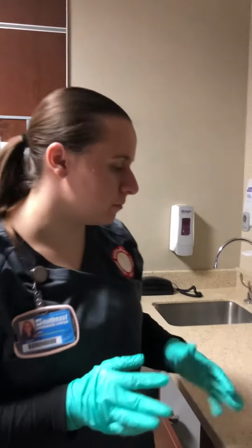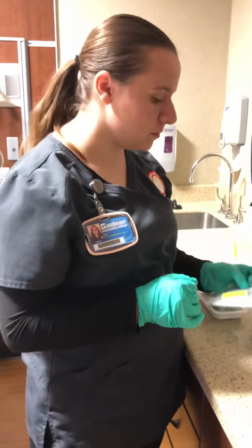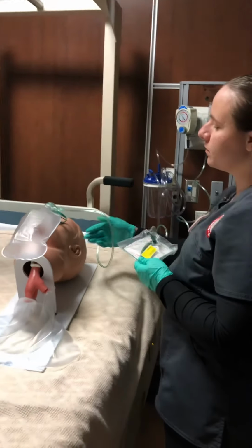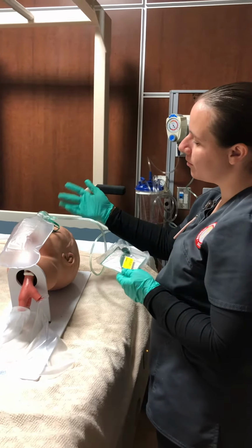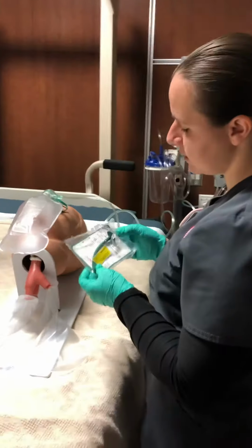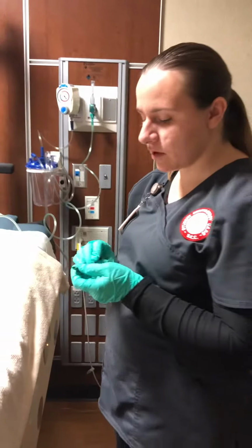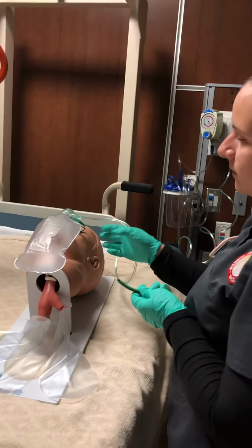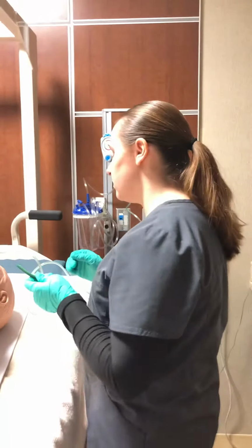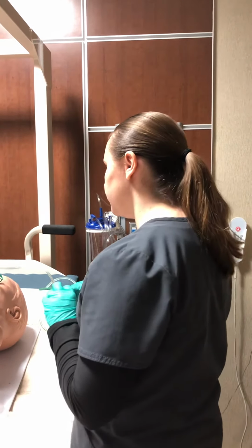And then with nasotracheal suctioning, you can place in a nasal trumpet for the patient if you have them available at the facility. What you would do is measure from the ear to the nasal opening here, the nostril there. When we find the right size, you can also tell by looking at the bevel. You can look at the bevel compared to their nose, to see if it's too big or too small, so that you can place it into their nose very nicely and not cause any trauma to their nose.